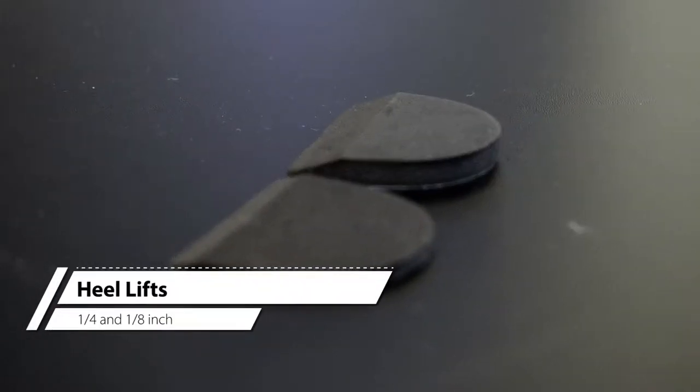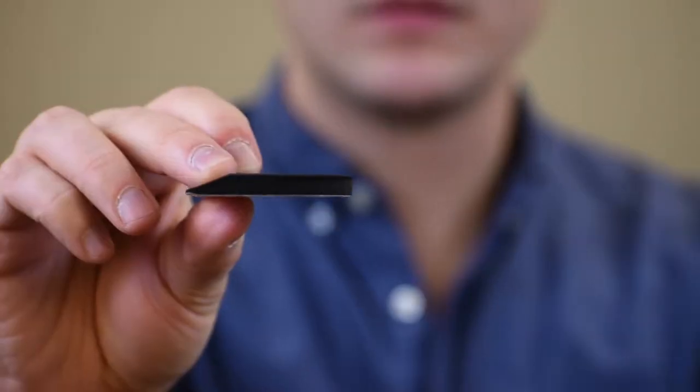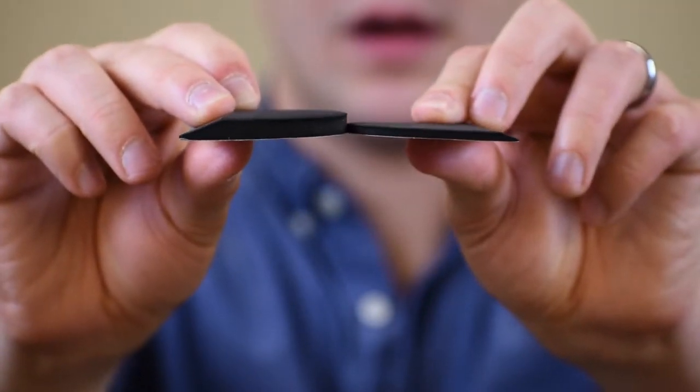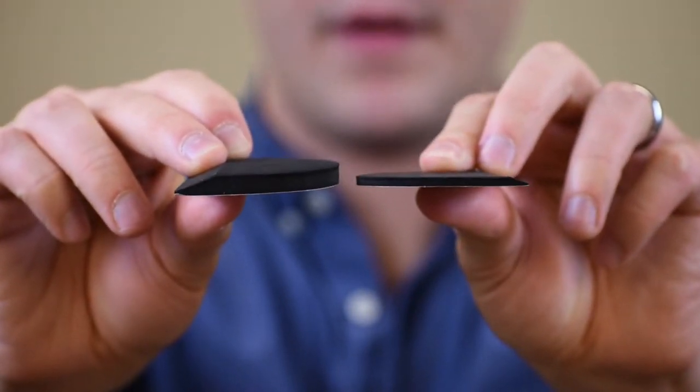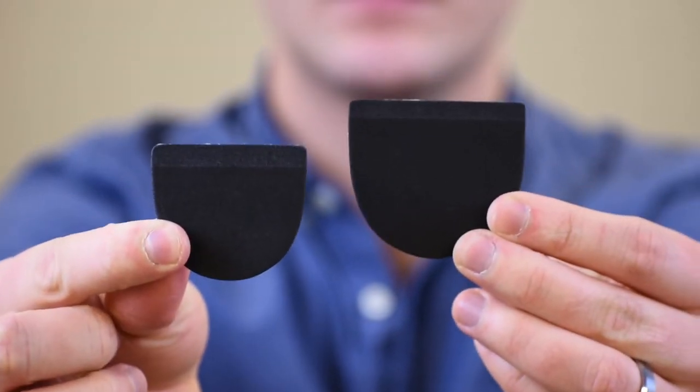Heel lifts are used to correct leg length discrepancy. These come in two different heights: 1/4 inch and 1/8 inch. Each height comes in two sizes — small for most women's sizes and large for most men's sizes. Heel lifts can also be stacked if necessary.